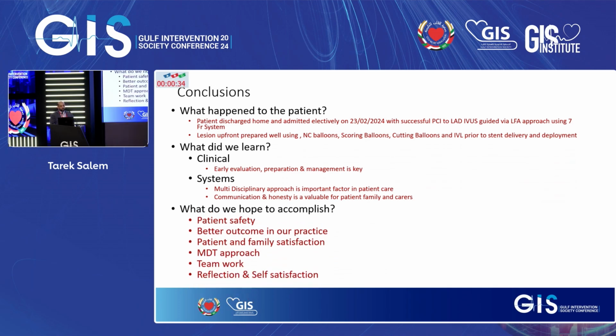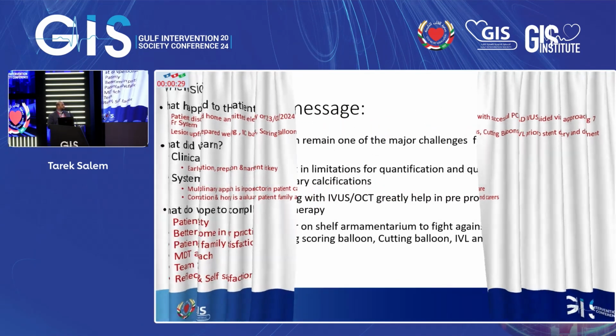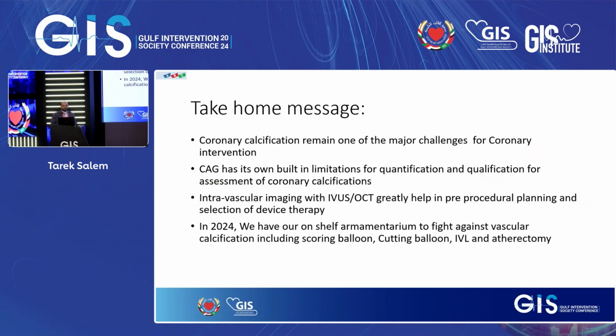I think it's important that we look at what we've done and we reflect on what we do. So my take home message: coronary calcification remains one of the major challenges for coronary intervention. Coronary angiogram has its own built-in limitations for quantification and qualification of coronary calcification. Intravascular imaging with IVUS or OCT greatly helps in procedural planning and selection of device therapy. And we're almost in 2025. We have on our shelf an armamentarium to fight calcium. So just keep that in mind.